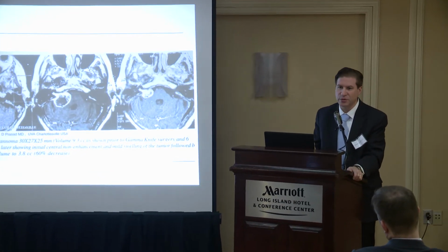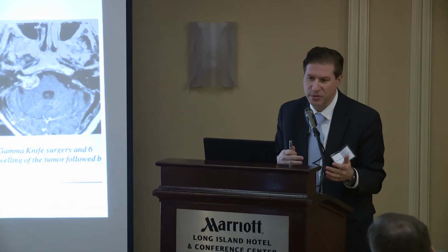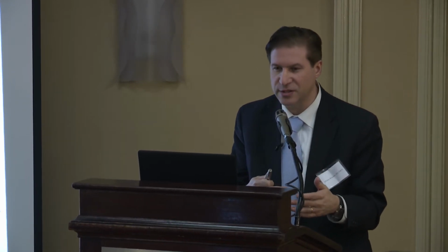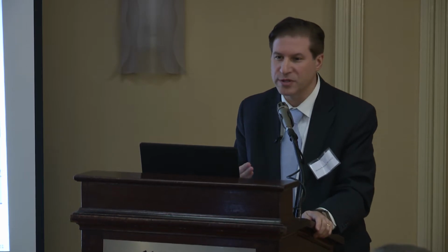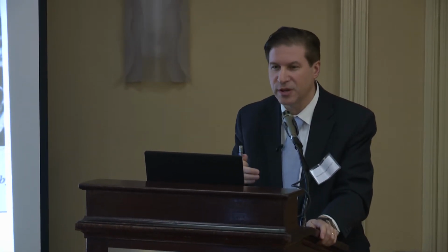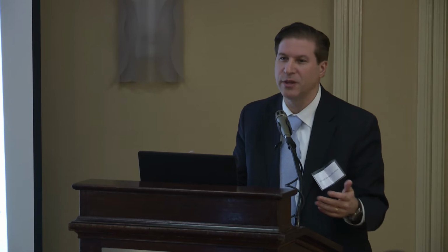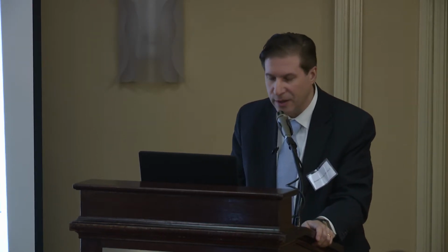And as far as hearing preservation, it's about 60 to 70% of what it is going into the treatment. So if they have no hearing coming in, they're not going to have it afterwards. But if they have good hearing coming in, there's a good chance that they will preserve the hearing at the level that they come in with. And that's one reason to consider Gamma Knife earlier rather than later, because it's unpredictable. How will the hearing deteriorate over time? Sometimes it's sudden, or you wait a bit and it deteriorates, and then you can't really get it back. Or it's hard to get back.